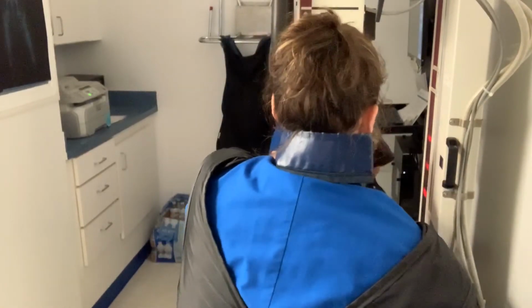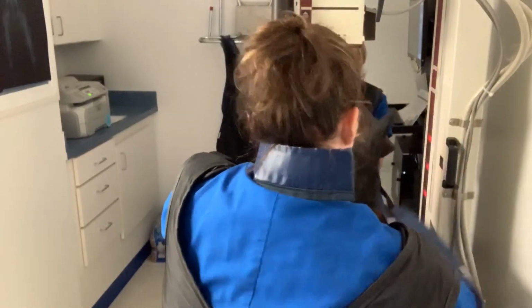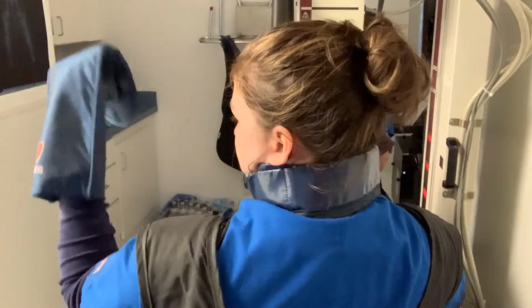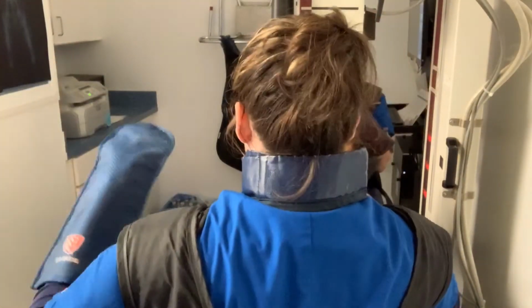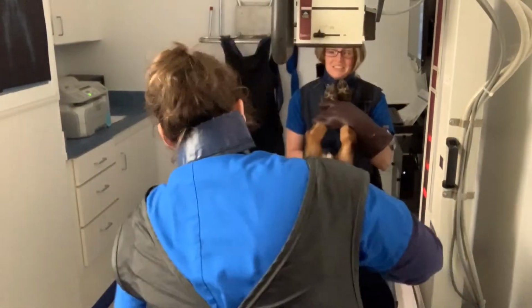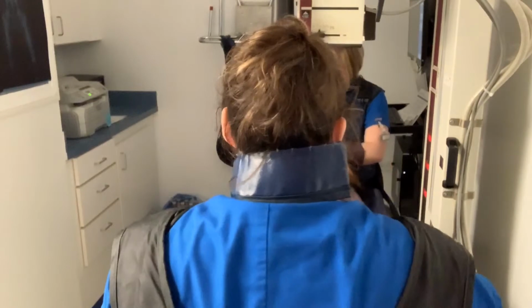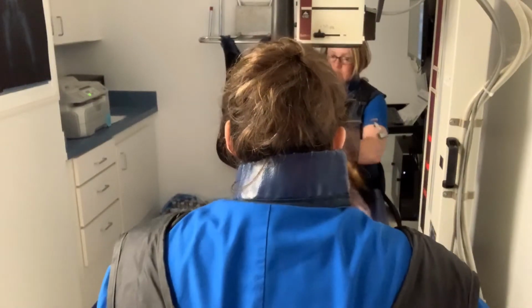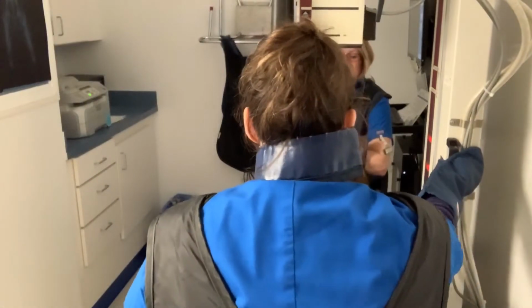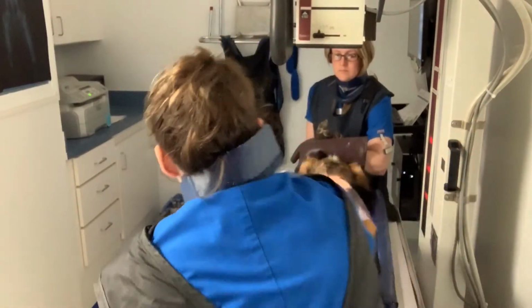Precautions to think of before proceeding with the study: if rupture or perforation is suspected, use water-soluble organic iodides, but in dehydrated patients, avoid the use of such agents. Ultrasonography would be overall safer for diagnosis in compromised patients. Delay the study if the stomach is full of ingesta.